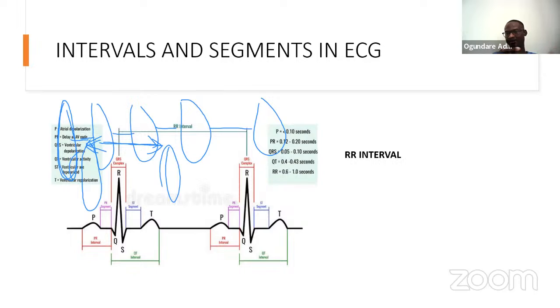Okay, and when you hear them talking about maybe ventricular tachycardia, I'm sure many of you have heard about VT, ventricular tachycardia. I don't want to be talking about fibrillations yet, but you've heard about tachycardia. Obviously you've heard about ventricular tachycardia, which is a common rhythm. This is how you identify that there is tachycardia going on with these patients. So it's not rocket science like many of us have taken it to be.